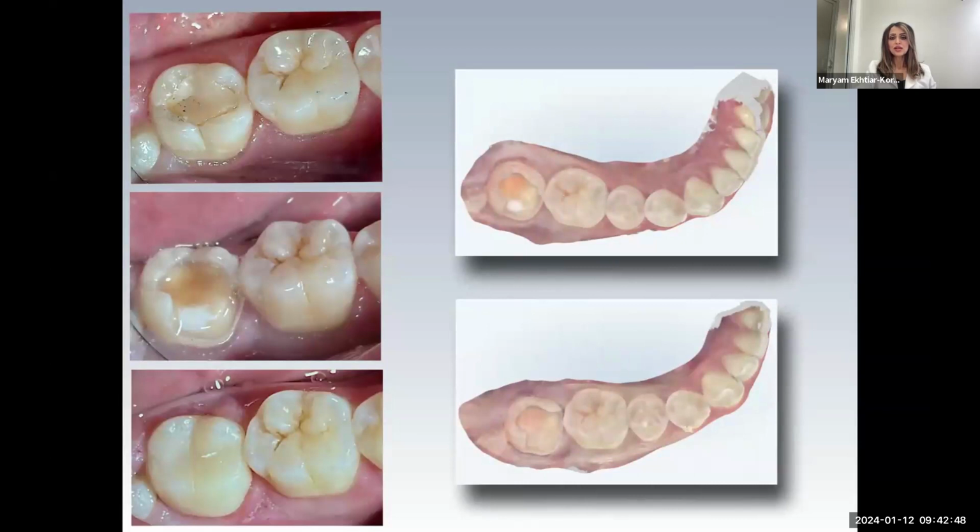After scanning, I realized I'm not comfortable with having my restoration and the patient's enamel touch right at the juncture of the adjacent tooth number 30 at the distal lingual cusp. So the beauty of an intraoral scanning machine is that you can go back and rescan the patient, which is what I did.